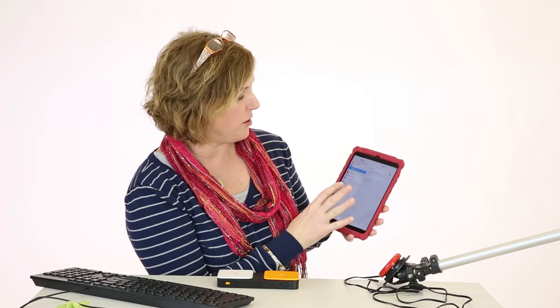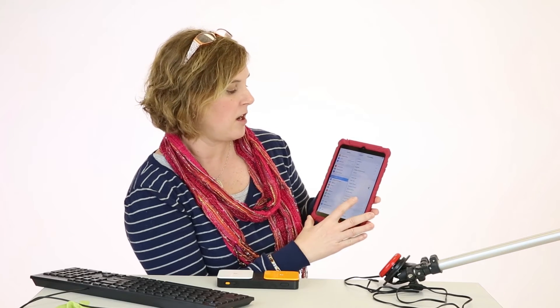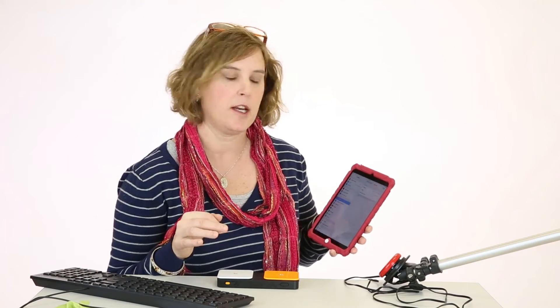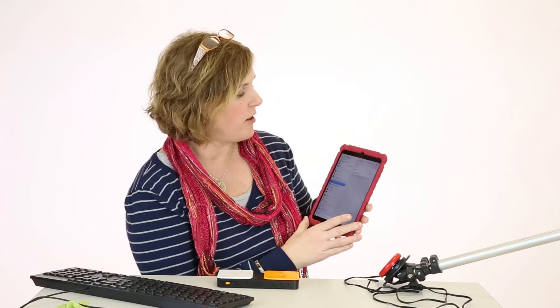The next thing we want to learn how to do is name our switch. Still in settings, you go down to General, then click on Accessibility, then click on Switch Control, and then Switches. It'll be the external component. I've already gone ahead and named them orange and white accordingly. The orange one gave me several options — I chose 'Move to Next Item' — and then I named the white switch 'Select Item.'